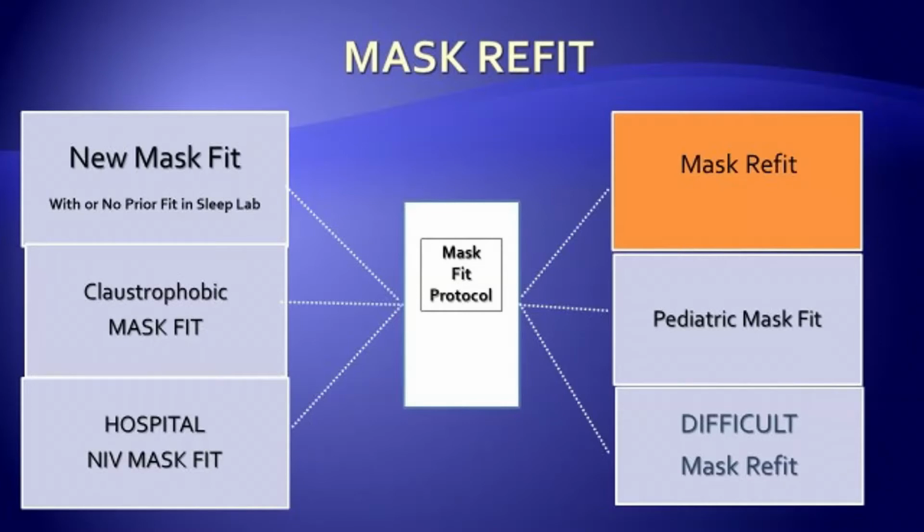But where you really need a strategy is when you have a patient who has failed either CPAP or BiPAP by failure to make compliance. He hates the machine, he hates the mask because of his failure, and you are trying to convince the patient to accept the mask and continue.